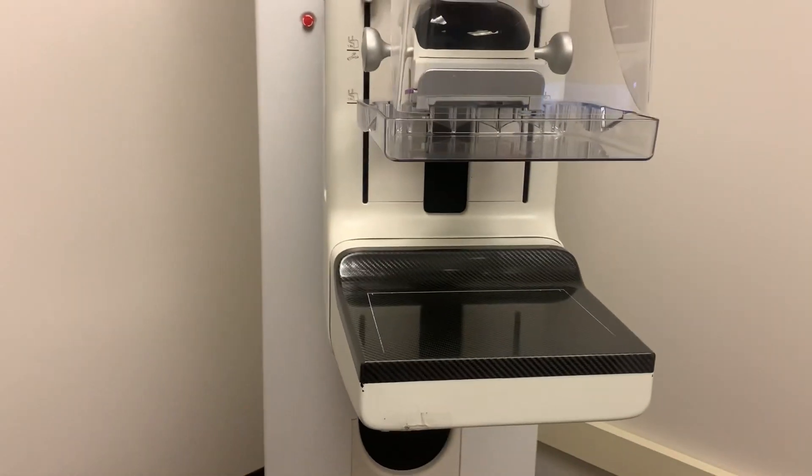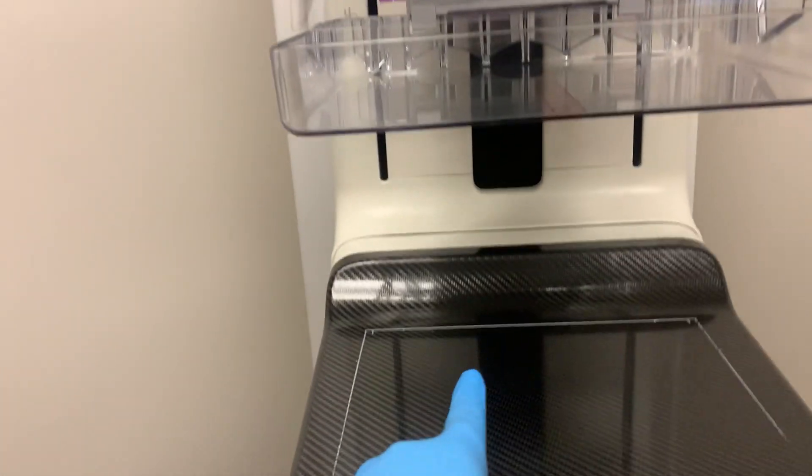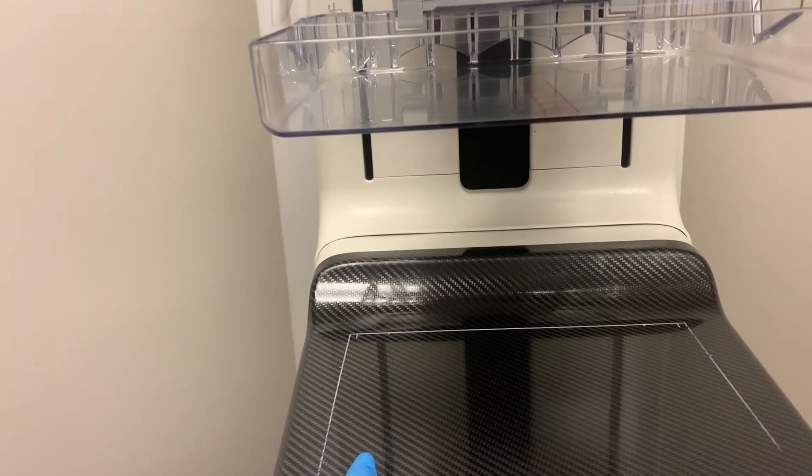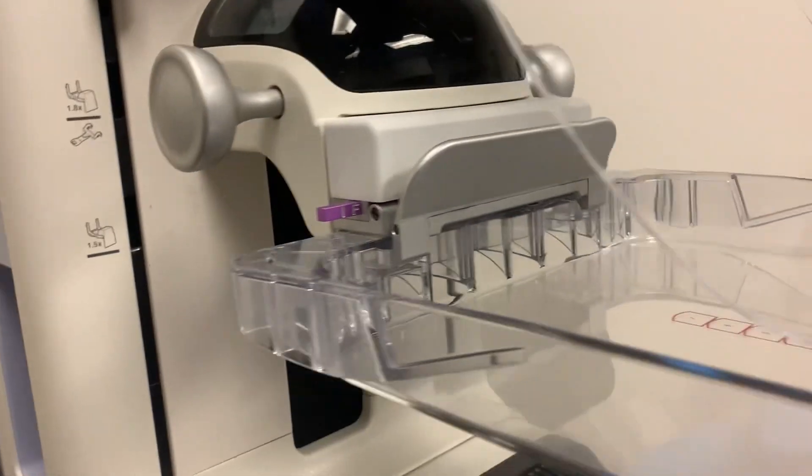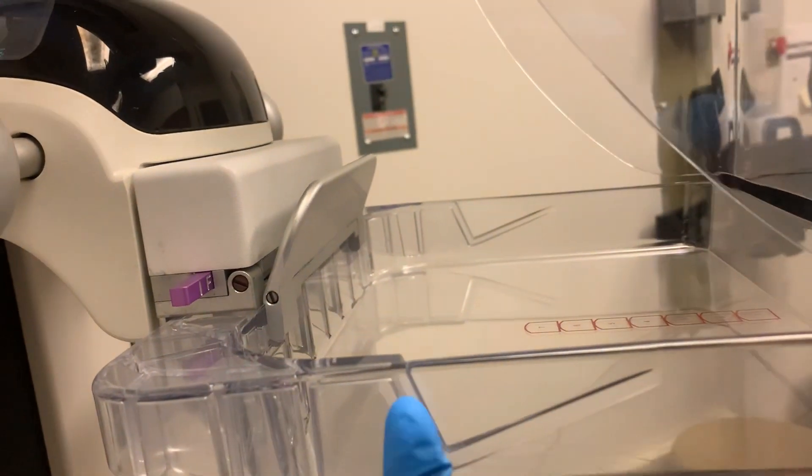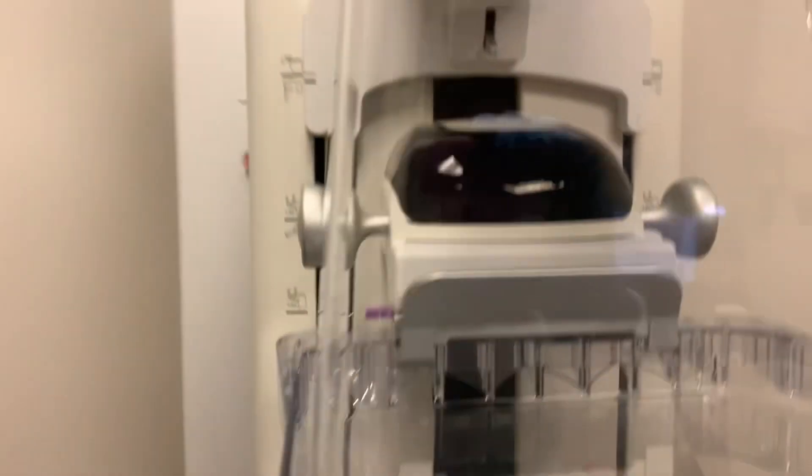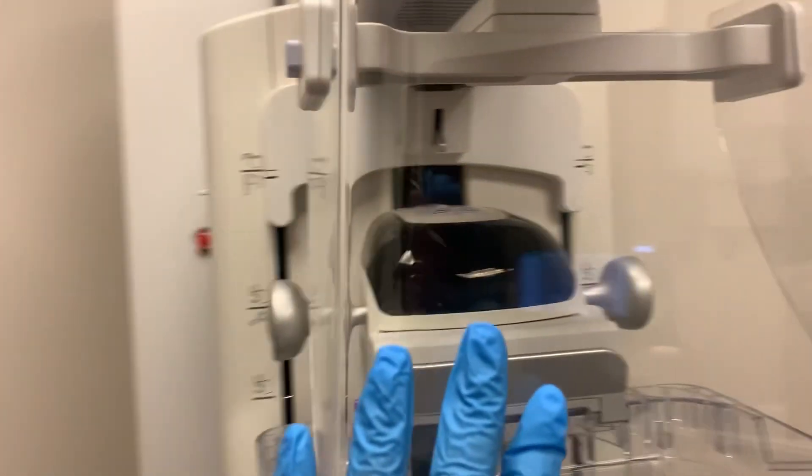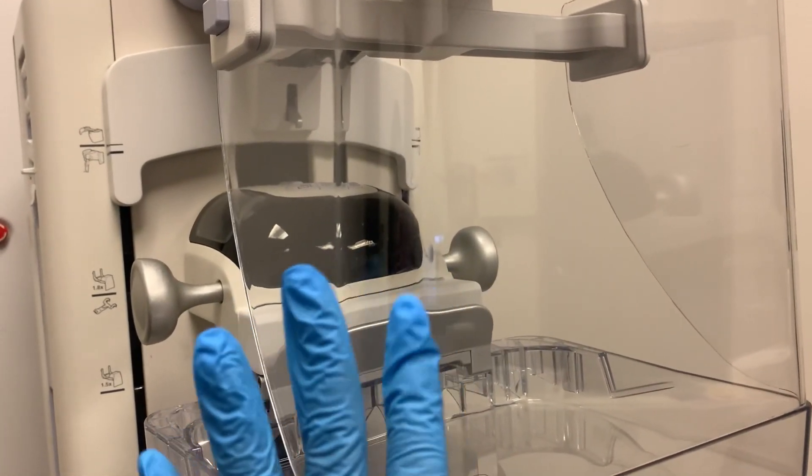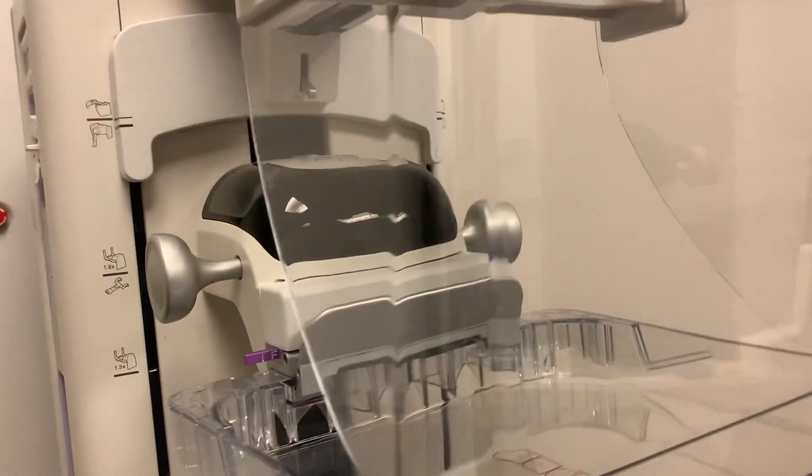For this video, this is the detector. This is where the breast fits, one breast at a time. We have our compression paddle. This is what is going to come down to squeeze the patient's breast. And then you have your face shield. This is going to stay right here so that the patient's head does not get in the picture whenever they lean in.